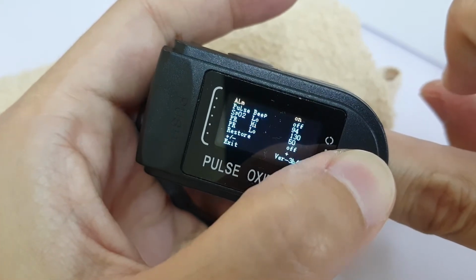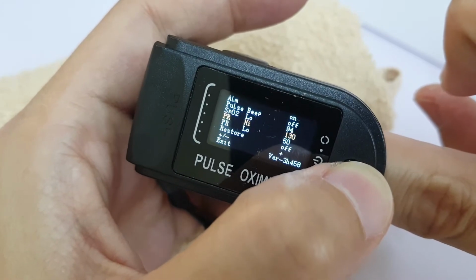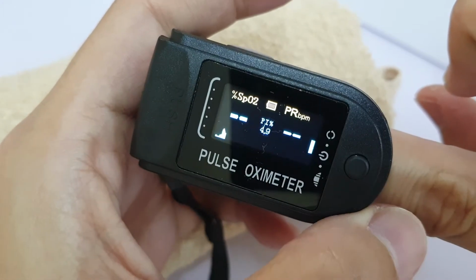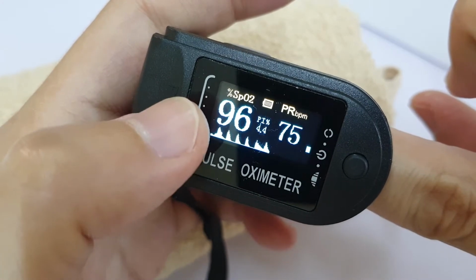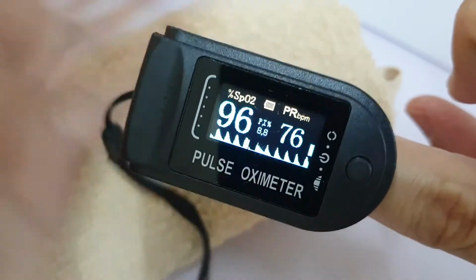If you long press, it may get into a configuration menu where you can turn off alarms and so on. And then to select one of these, you just long press. Okay, so I'm back to pulse again. Here you can see my SpO2 is 96% versus 75 beats per minute. So I just want to show you that.